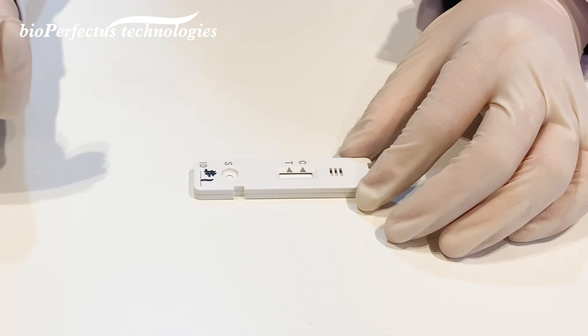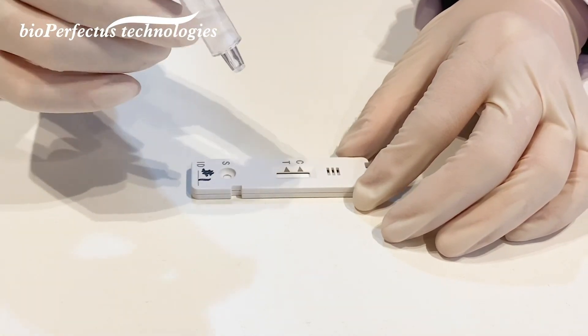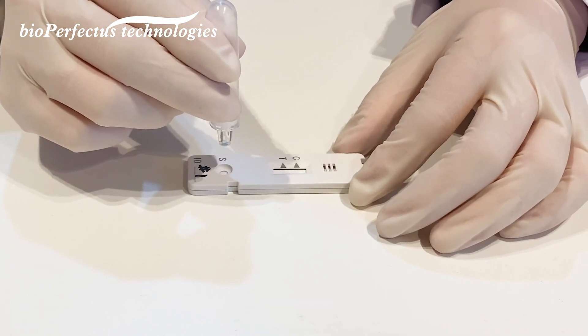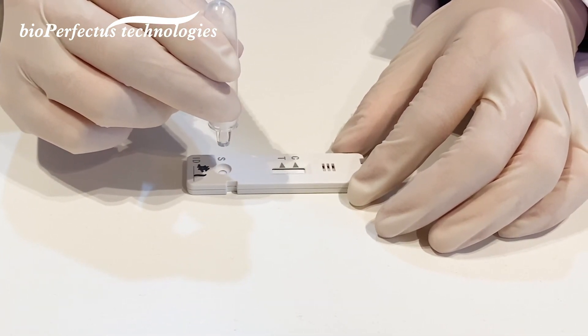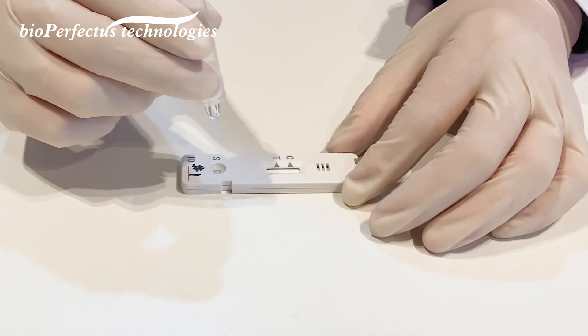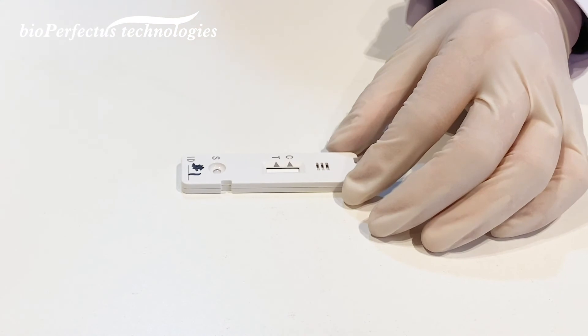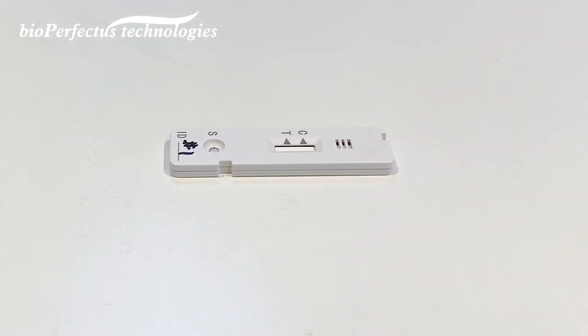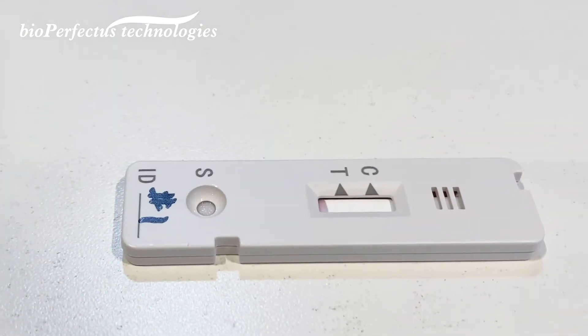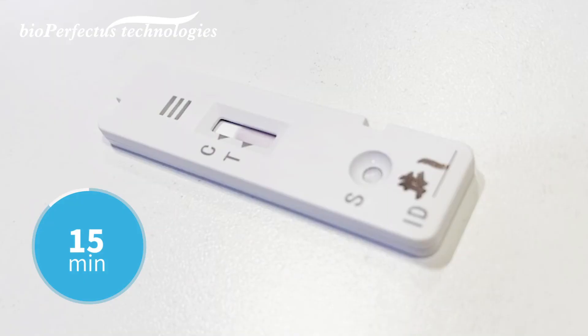Step three: take the test cassette out from the package and place it on a table at a horizontal level. Add two drops of swab eluate into the sample well of the test cassette, then wait for the result. The result will present in 15 minutes.